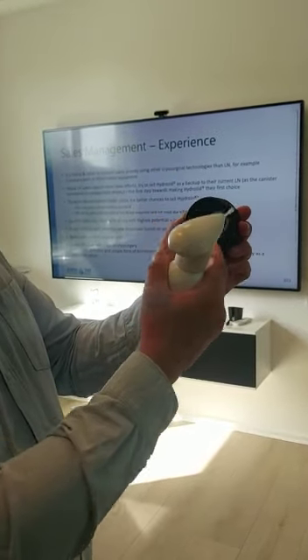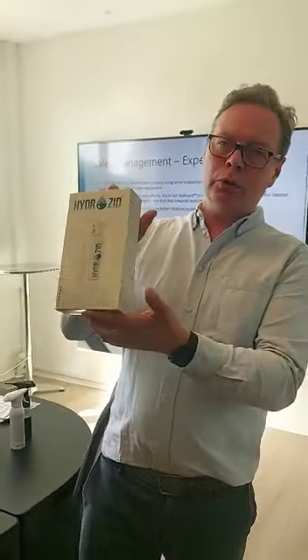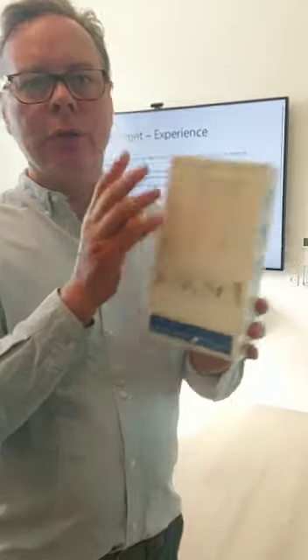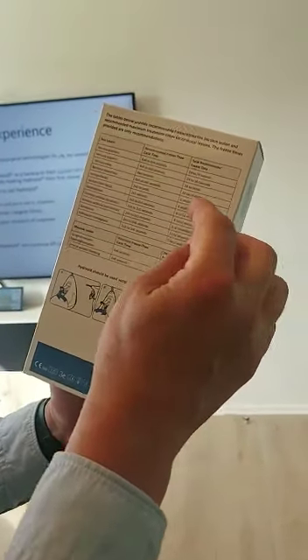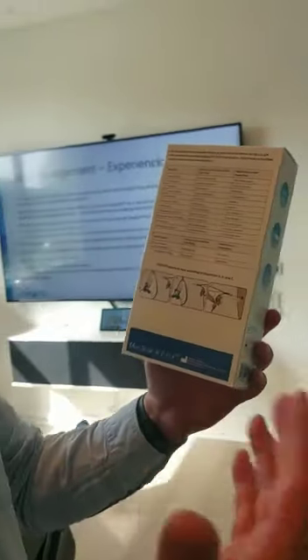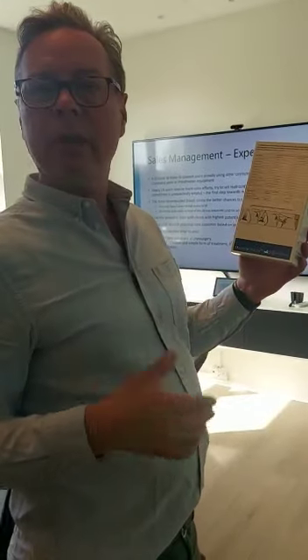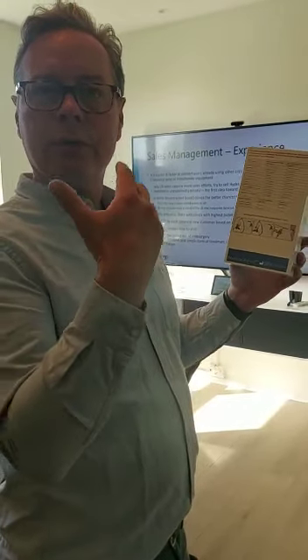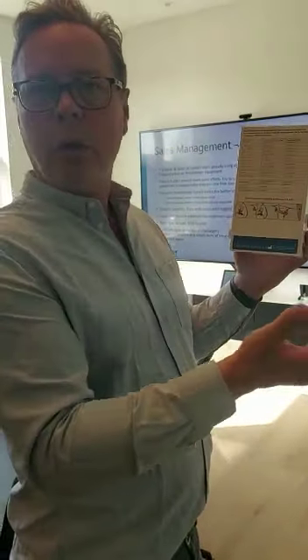If you push too hard it just runs and crystallizes. On the box, on the back of the box, you have all the approved conditions, and in the middle you have the recommended freeze-thaw cycles. I would definitely look at those because they are very important — you don't want to freeze too long on a lentigo, as you can make hyperpigmentation if you freeze too long.